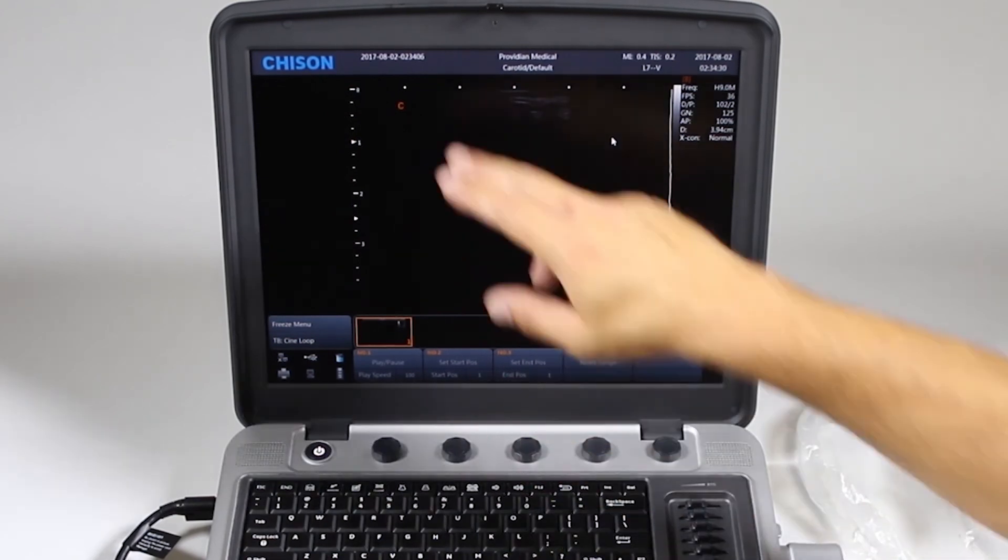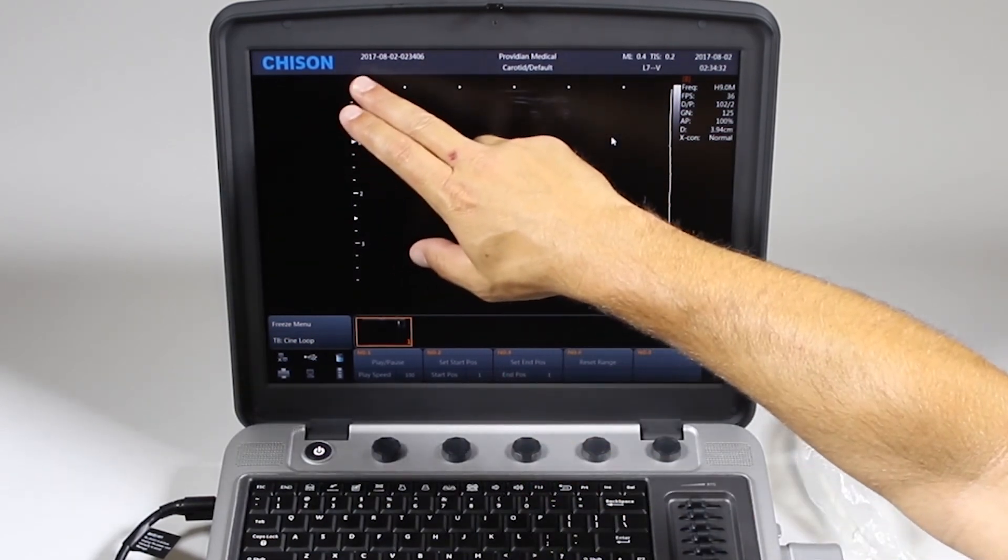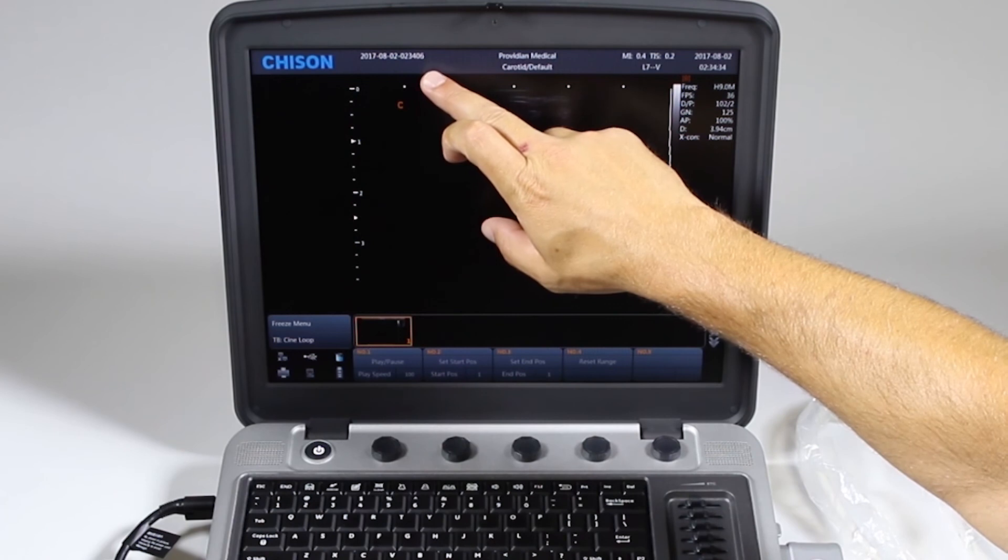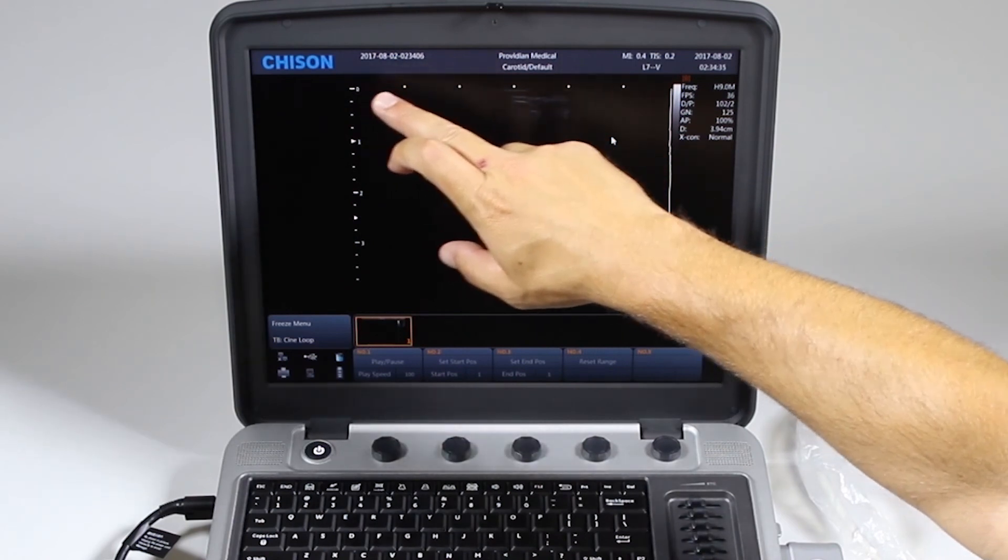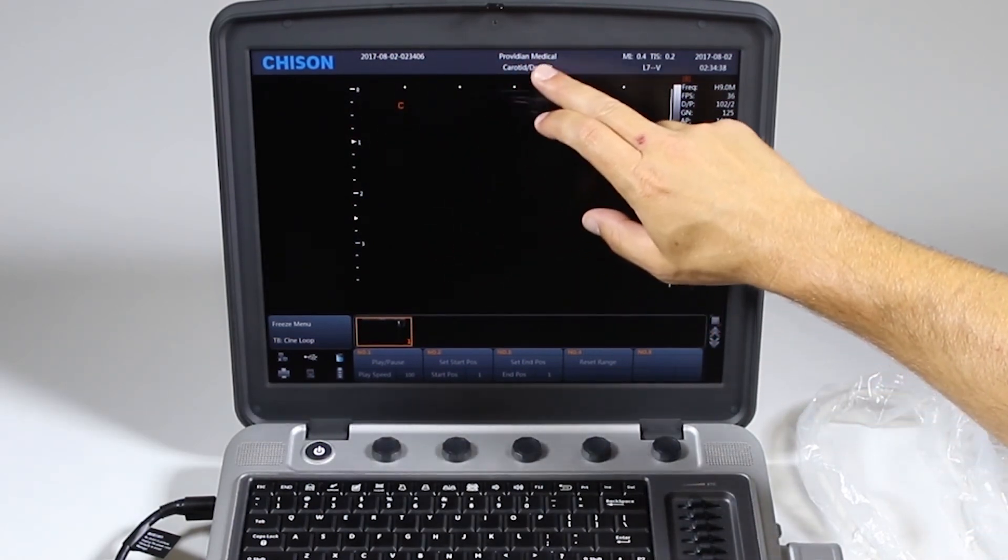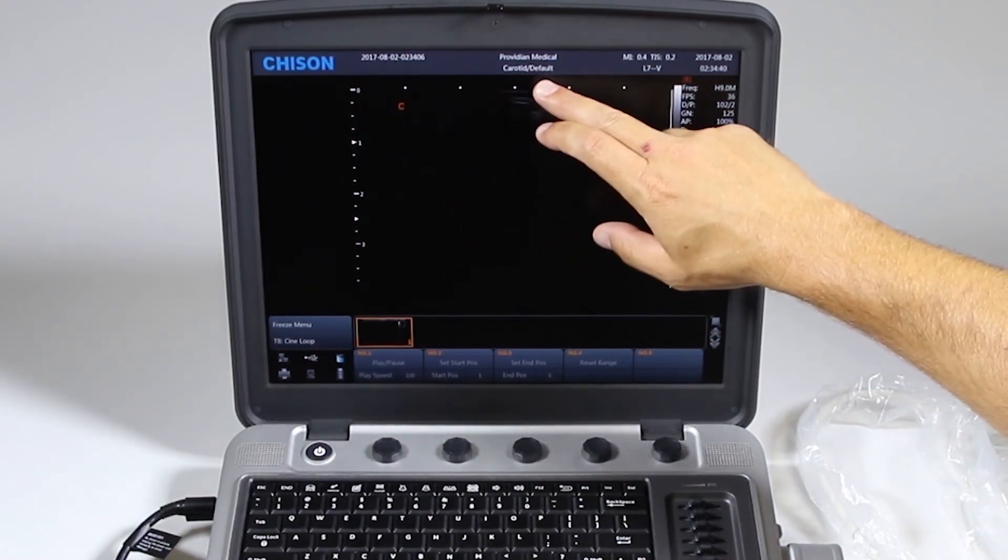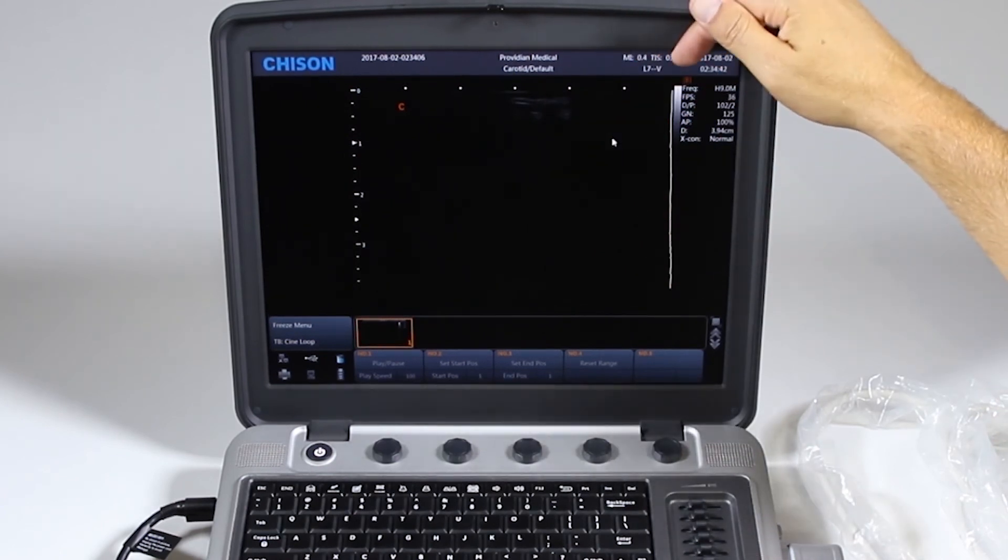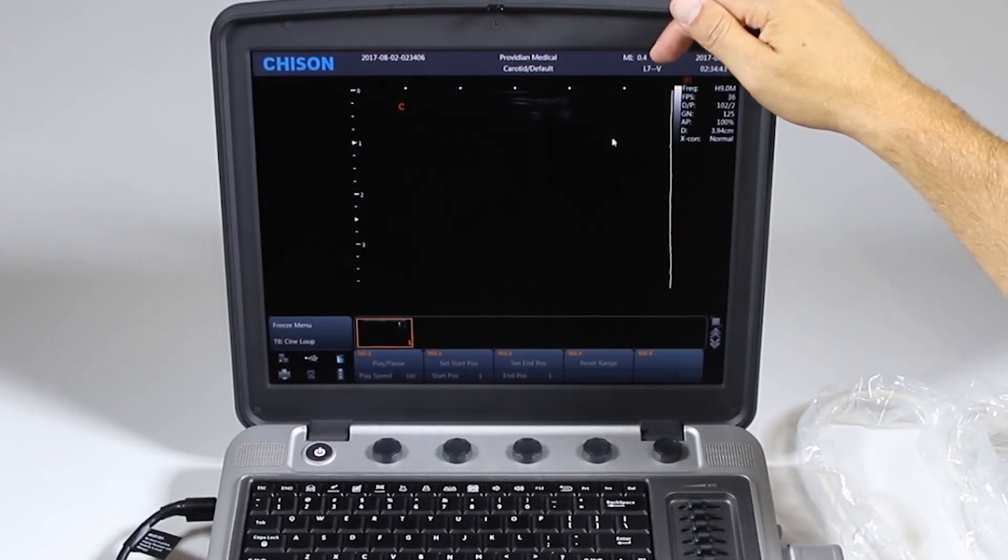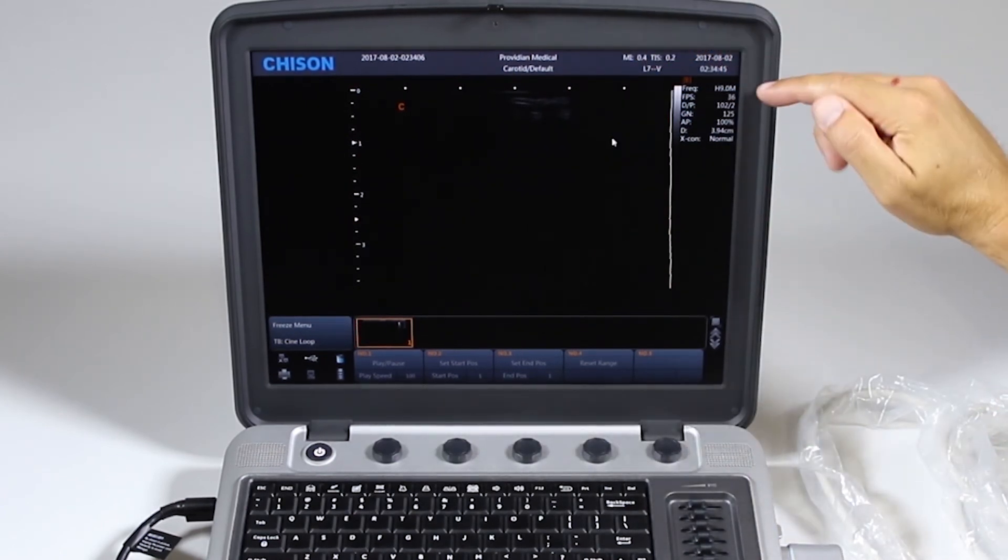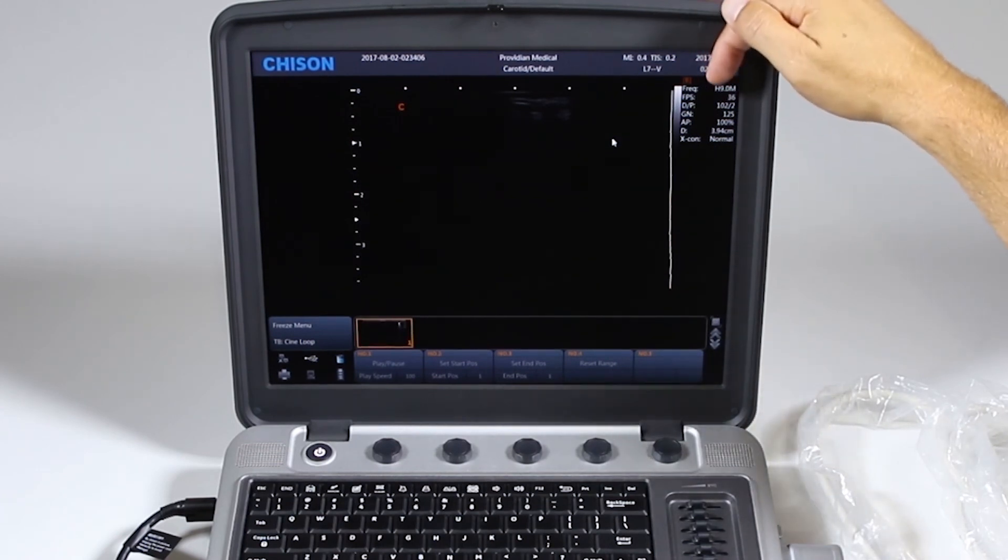Across the top, we'll have the, obviously, manufacturer name, patient ID. The patient name will go here. Your facility name. The application that you're in. Mechanical and thermal indices. The probe name. Date. Time. And these are the parameters that show you your frequency, frames per second.